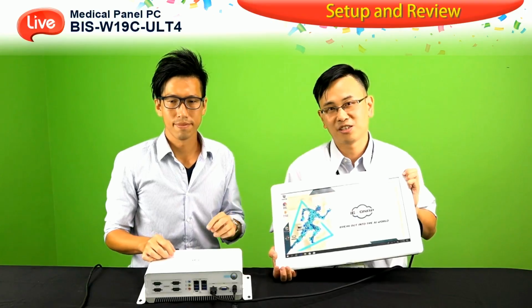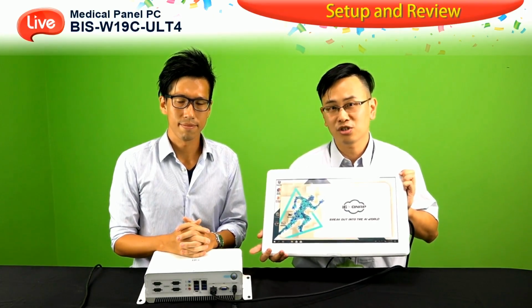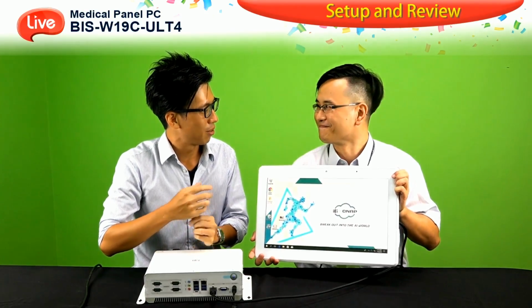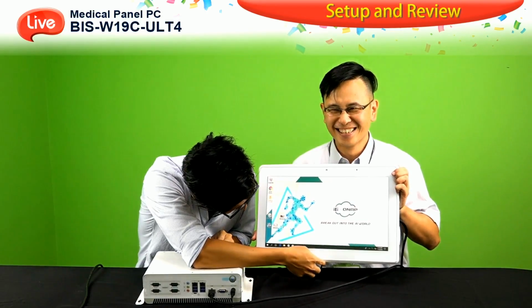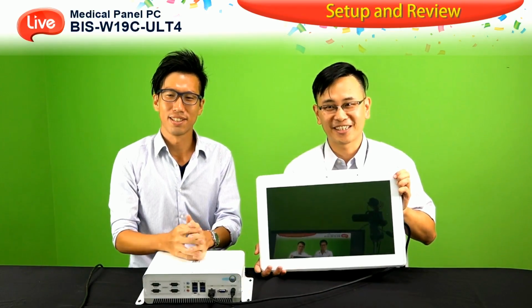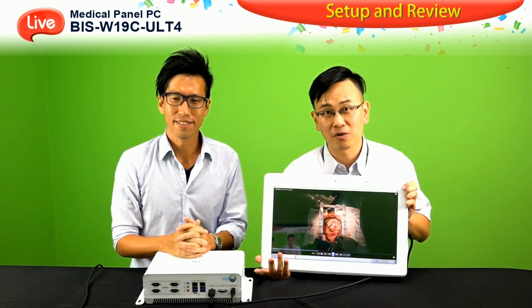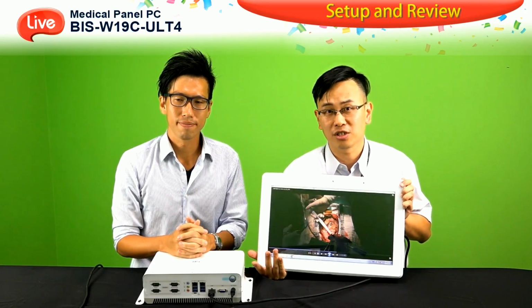So the function is very easy to demonstrate. The only thing you need to do is just press the button, and it will switch into the monitor mode. I really want to press. Okay, do it for me. Okay, now you can see it's switched into the monitor mode. And we are trying to simulate the situation in the operation room.